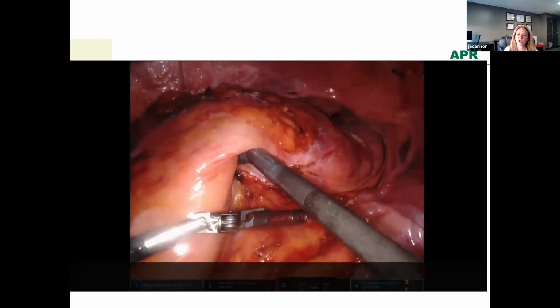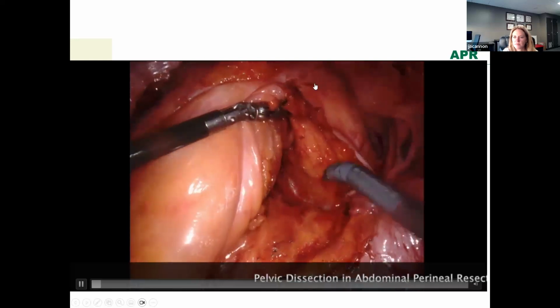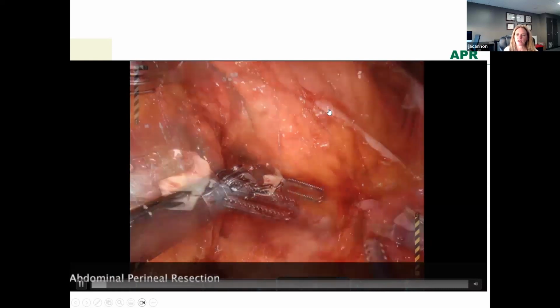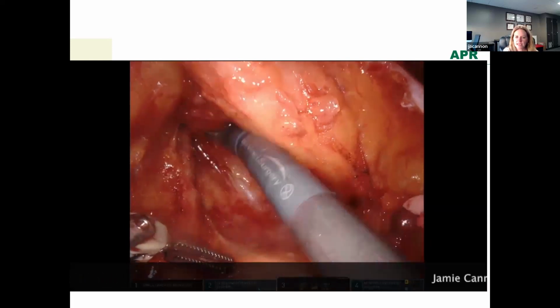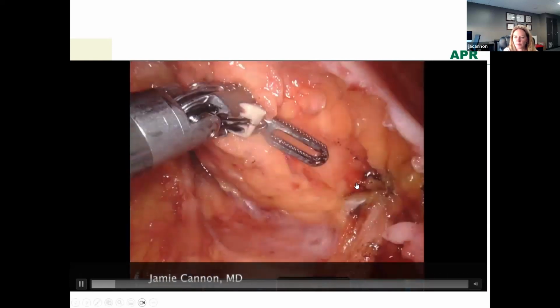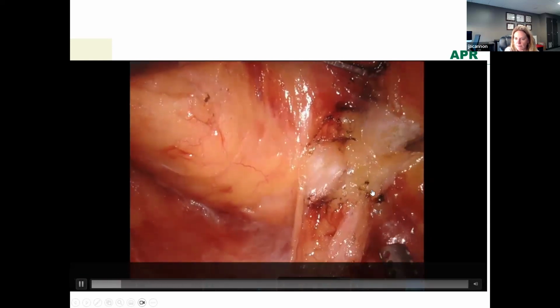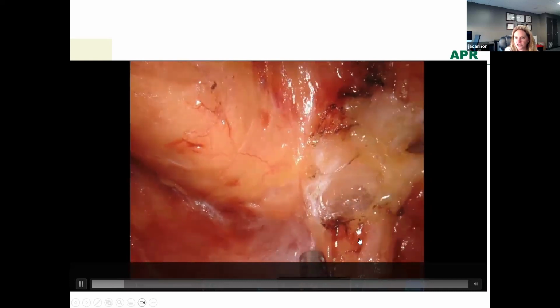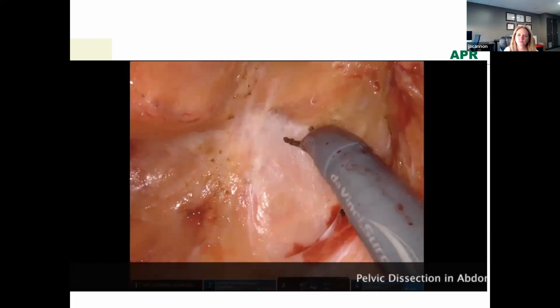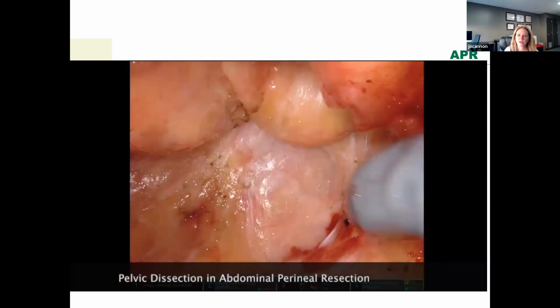So here's another example. In the pelvic dissection, my grasping retractor is coming in underneath the mesorectum, and it's pulling our mobilized rectum up and out in order to get that redundancy up out of the pelvis. And then my bipolar is coming down and giving me additional anterior traction so that I can see these planes where we want to divide. Our planes become visible. Your right hypogastric nerve is going to be somewhere in this fatty tissue here, and so we're dissecting that away from our mesorectum, and then continuing that posterior dissection down into the pelvis.